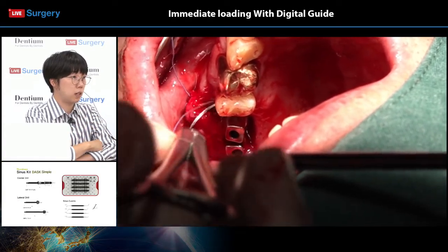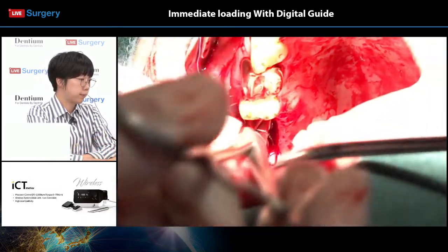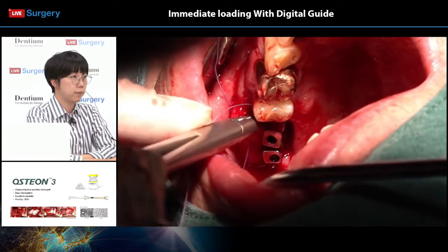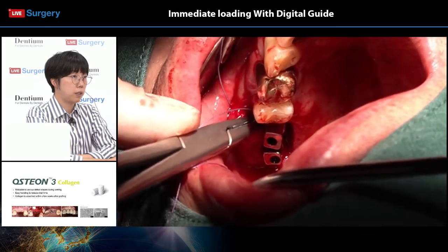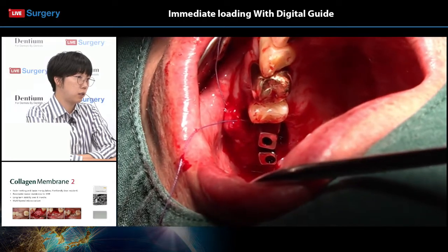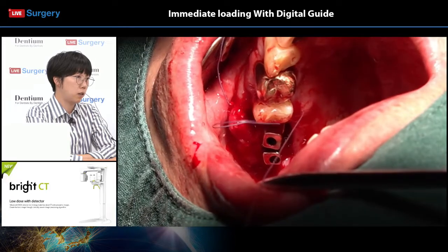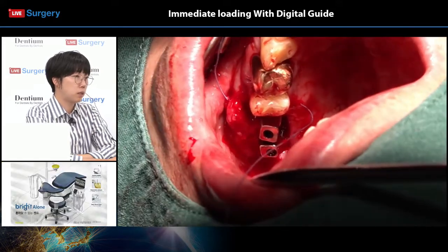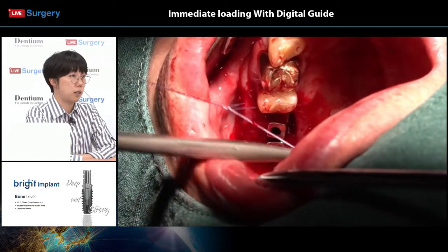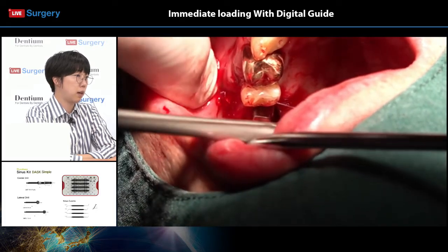Okay, Dr. Lee is now performing the suture. The operating team has just informed that they will be taking an x-ray after the surgery, after finishing the suture on the upper right area, which we are seeing now. So during that brief moment, we'll have a short break. The x-ray taking will take about 3 to 4 minutes.